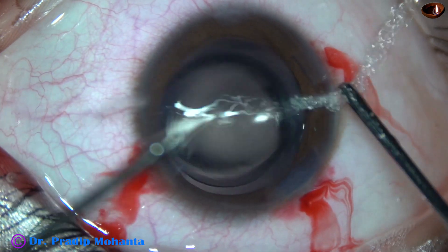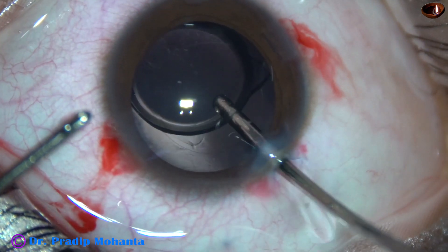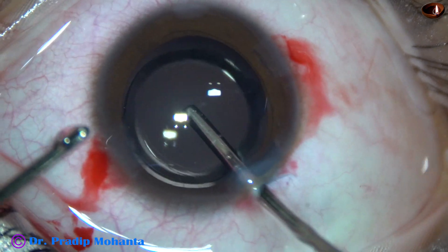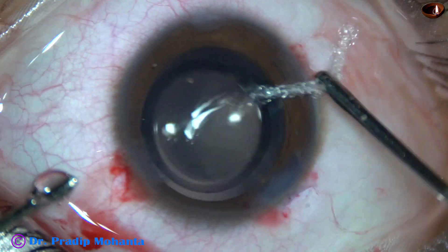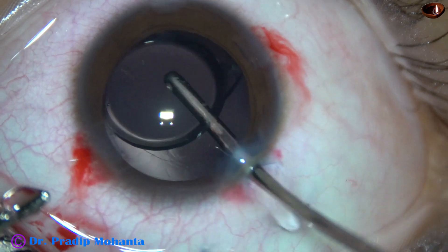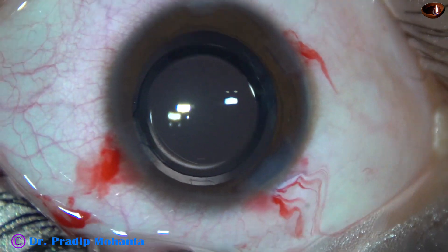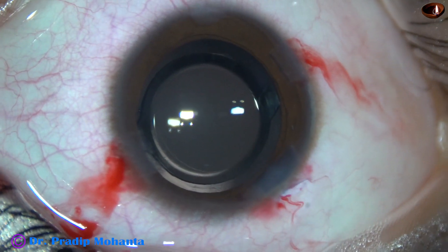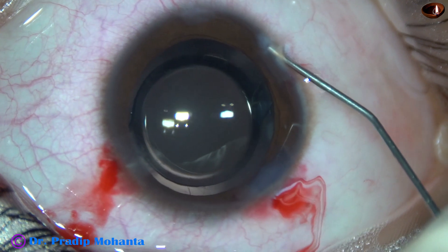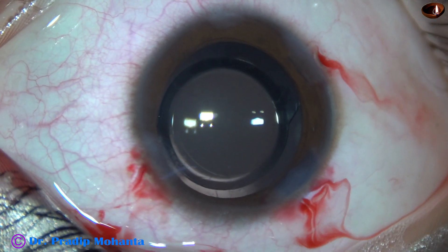We just have to calculate the intraocular lens power in such a way that we don't get a refractive surprise. We should always undercorrect the refractive error. We should always keep the patient a bit hyperopic because there will be a myopic shift in course of time. The side ports are now closed.